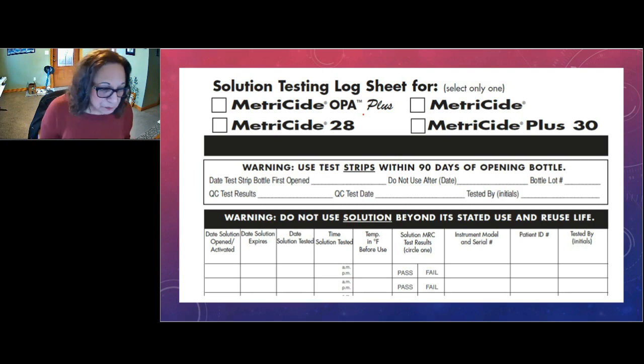Now, with that said, my question to you would be, so how are you cleaning that carpule? Where are the instructions for cleaning the exterior part of that carpule before you put it into that sterilant? There are none, because it is a single-use item, and you cannot reuse it. That's not a safe practice.